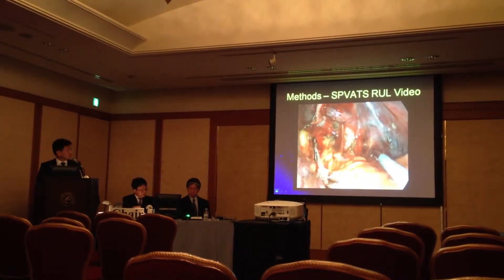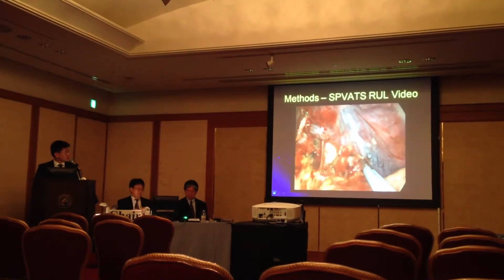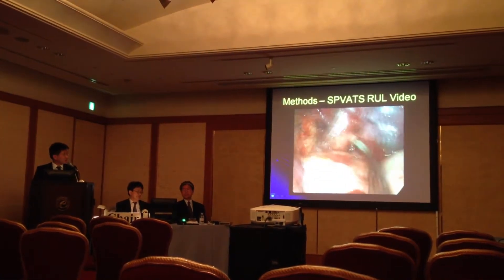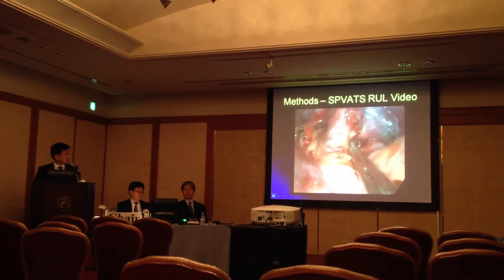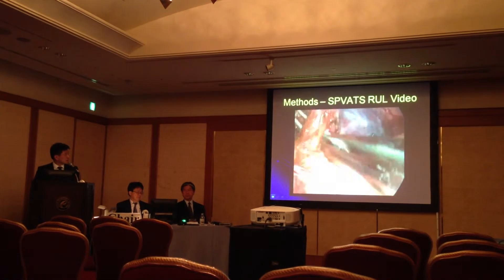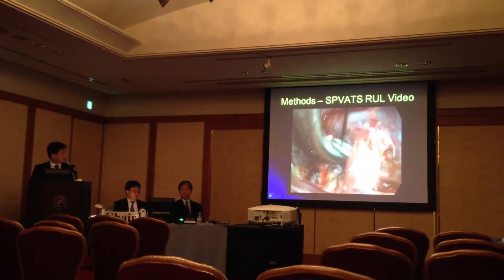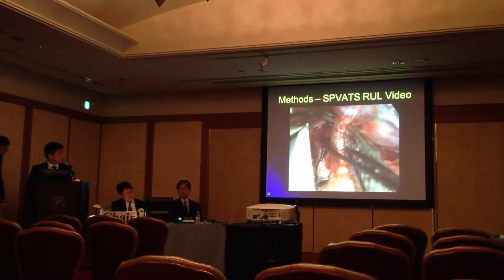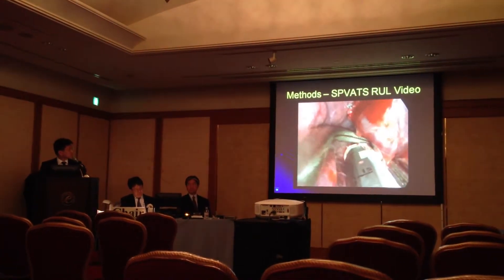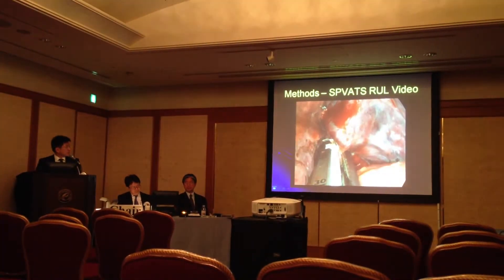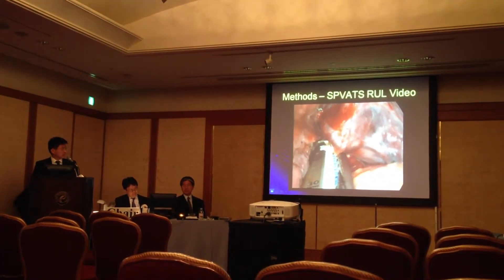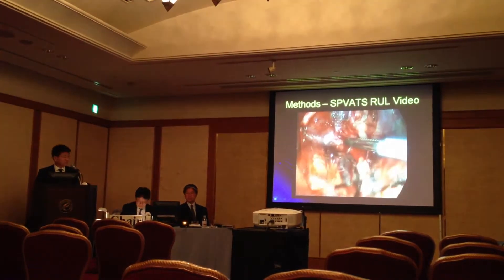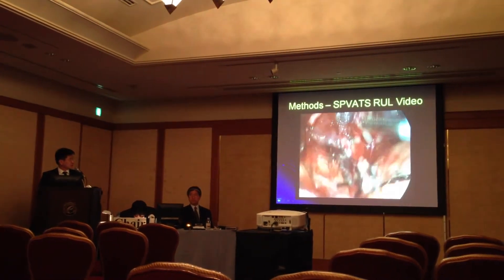After dividing the vein, we isolate the truncus anterior of the right upper lobe artery — very much the same way you would do a standard three-port VATS. We go around with the right-angle on both sides to isolate the pulmonary artery and then divide it. Now that the power Echelon stapler has come out, there is a lot more stability and you don't need to apply as much force when you fire.